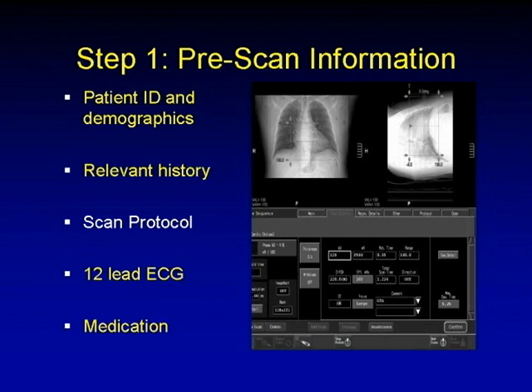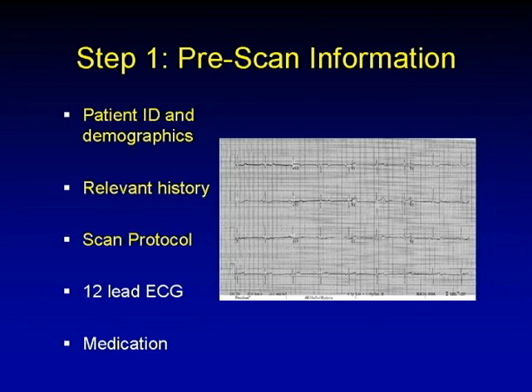Because that will determine our scan protocol, the length of coverage, and also the various protocols as outlined by Sean earlier, whether you use prospective, retrospective, and your scan coverage, etc. We perform our own 12-lead ECGs if we don't have one already supplied to us, and we interpret it ourselves. And also we look at the medication that the patient had. We use metoprolol orally almost exclusively, with IV to top up if required.